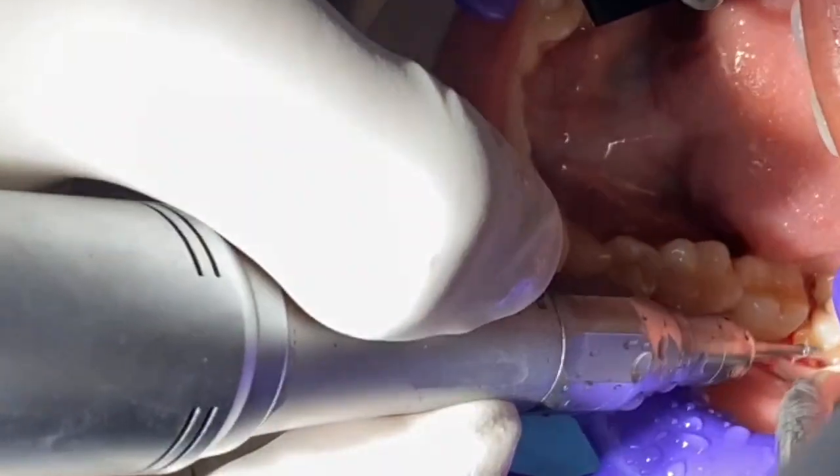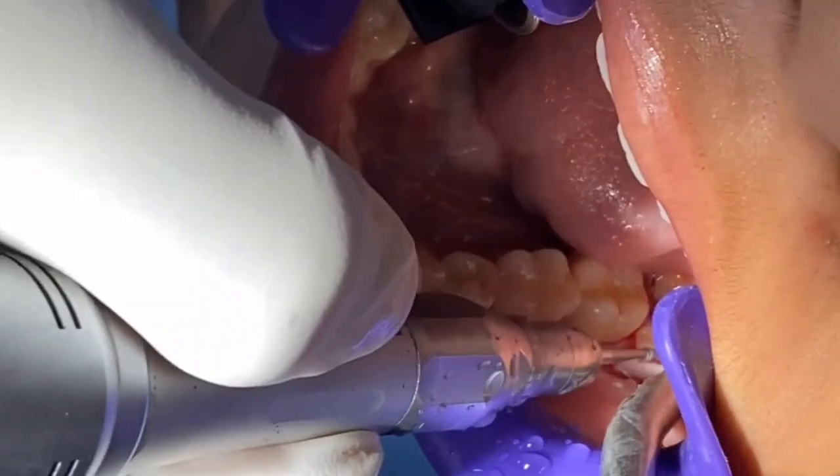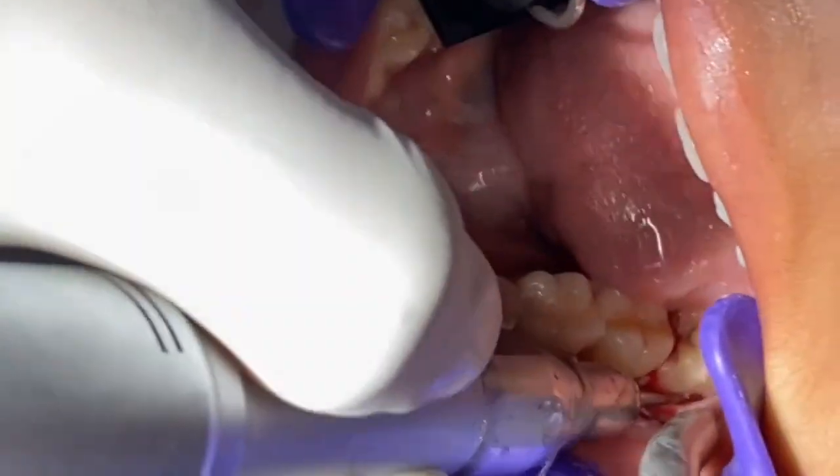Now I am going along the plane of this. So this is the tooth. I am seeing the tooth that I am doing. I am not cutting anything. This is the tooth I have to see.